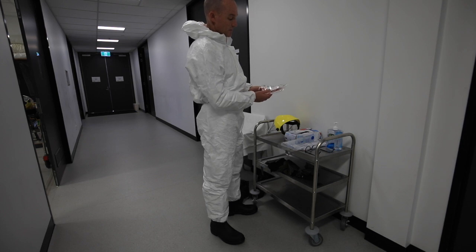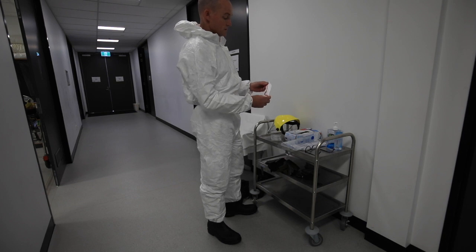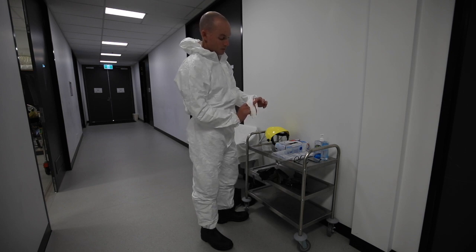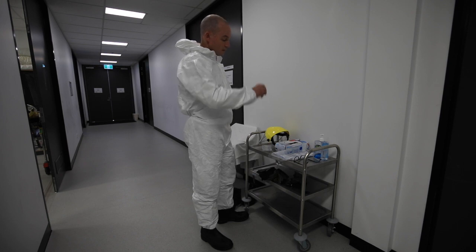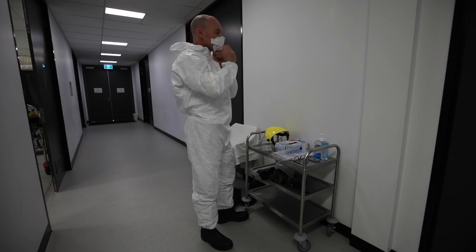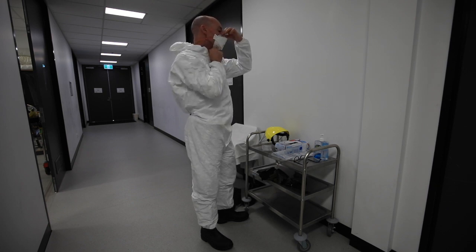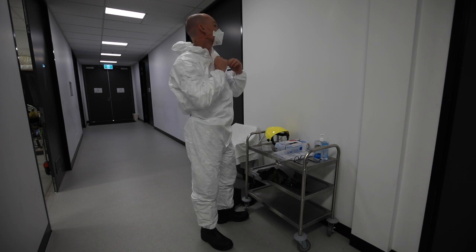I've now got the upper band behind the mask and the lower band in front. Just open the mask up slightly just in case, so you don't damage any of the filter material. Now apply the mask. Just confirm with your buddy that it's appropriately fit tested.